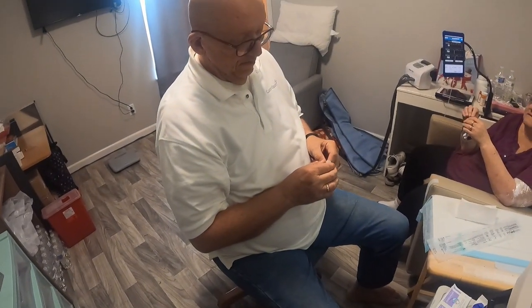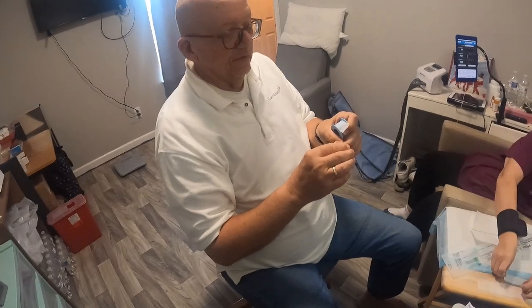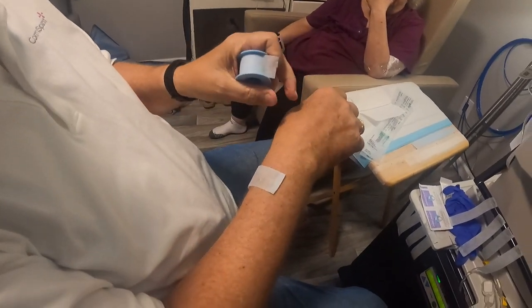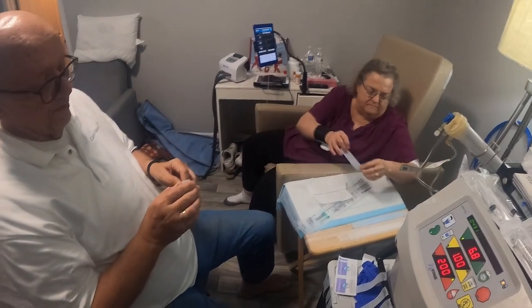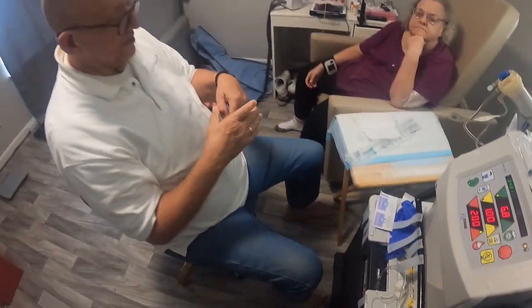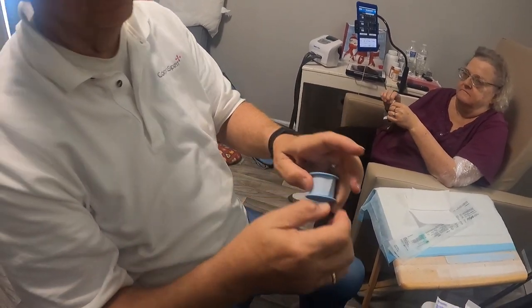And this is the prep. This is what it takes right here. So what are you doing, Dad? Preparing tape. You have to take these pieces of tape and bend both ends over. The reason you bend the ends over is so when you stick it to somebody's arm, instead of having to dig around, you can just lift the tab up. When we pre-make those, you can see I put four pieces of tape right there. Give me just a minute, and I'll show you what I did that for.